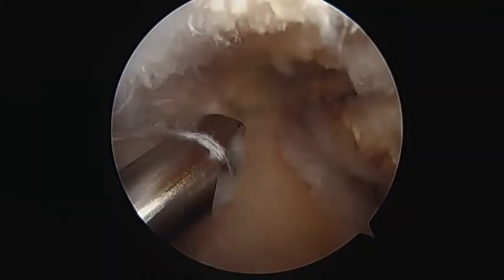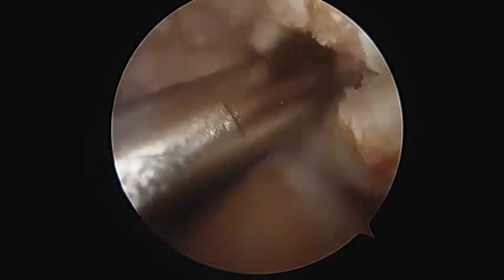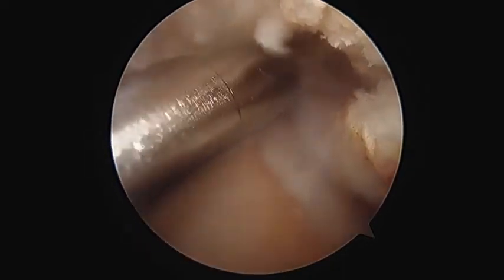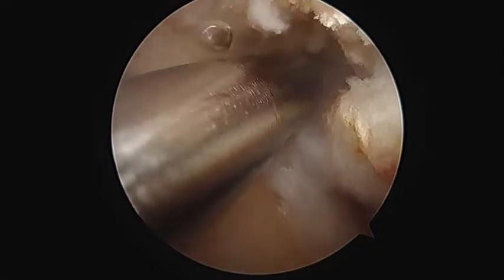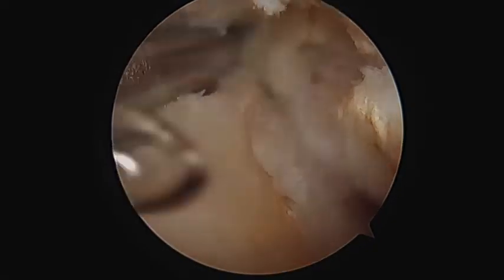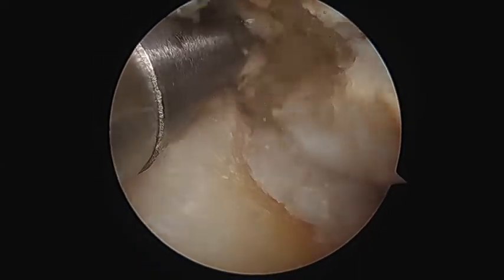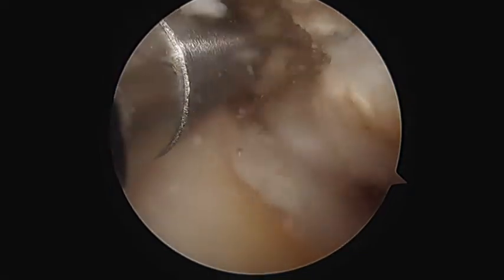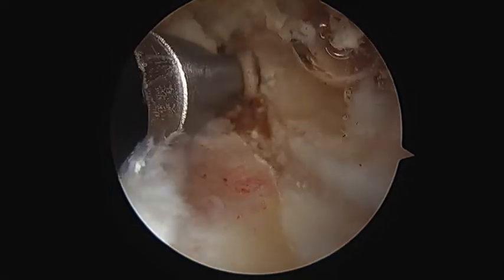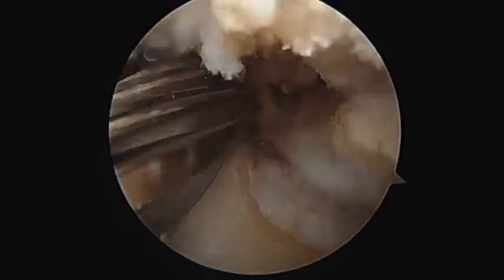Standard anterolateral and anteromedial arthroscopic portals were made, and diagnostic arthroscopy was performed. Access to the posterior compartment of the knee was needed for cyst decompression. Due to the arthritis, there were considerable osteophytes in the notch that impeded our access. Here, viewing from a standard anterolateral portal with a 30-degree arthroscope, an arthroscopic shaver and a radiofrequency ablation device were used from the anteromedial portal to remove synovium and expose the osteophytes along the medial wall.